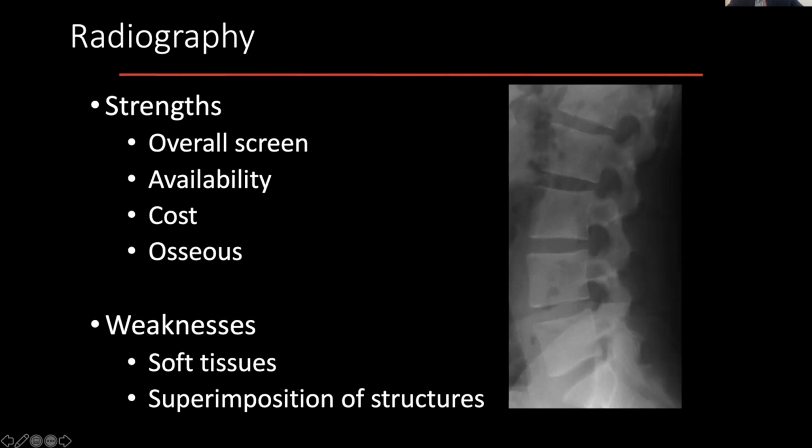But as spinal surgeons, you'll learn all about that in residency, the various angles and contours that you may need to consider before performing deformity surgery, particularly. And that predominantly relies on plain film radiography or some variant of plain film radiography.